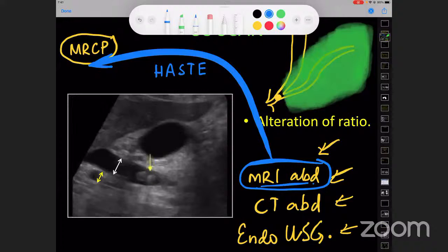Definitely, if it is within 1 day of pancreatitis, or with just the first approach, I don't think a contrast enhanced MRI would be a good option for him if it is not after 3 days. And if it is after 3 days, in a single shot, we can go for a contrast enhanced MRI as well to see the pancreatic necrosis and the extent of the disease.